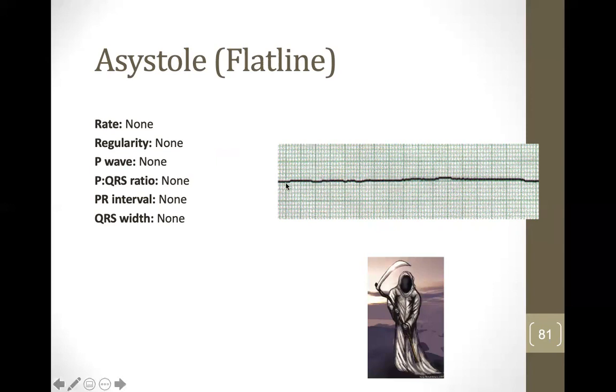Baywatch, there's a whole movie, Flatliners, about it, right? With Kiefer Sutherland, although I think there's a remake as well. When we are at a flatline, there's no electrical activity. We will not shock this. We will not use a defibrillator because it can't stop no electrical activity.